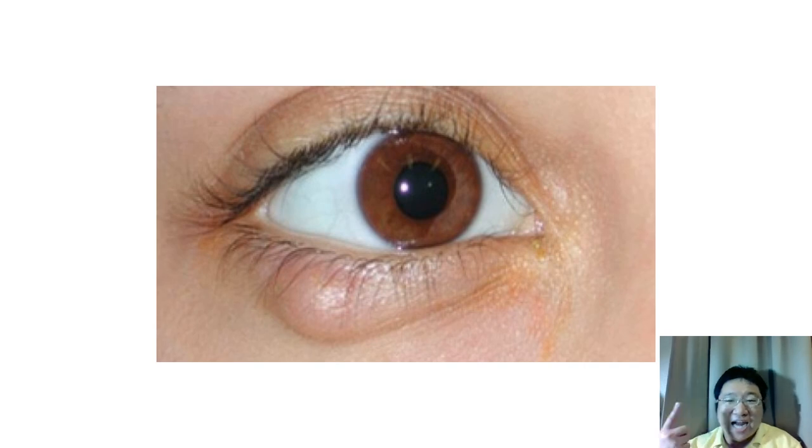So we see lipogranuloma. Lipogranuloma is the keyword for chalazion. C-H-A-L-A-Z-I-O-N, chalazion. This is chalazion, lipogranulomatous inflammation.